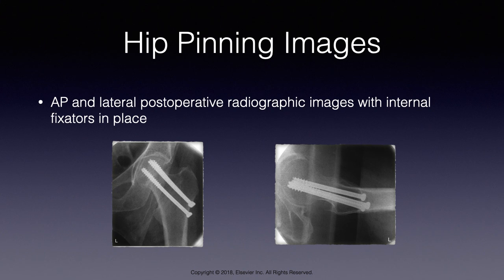On this slide, you see what the internal fixators, or rather screws, look like when you're doing a hip pinning. This is an AP and lateral post-operative radiographic image with internal fixators in place.